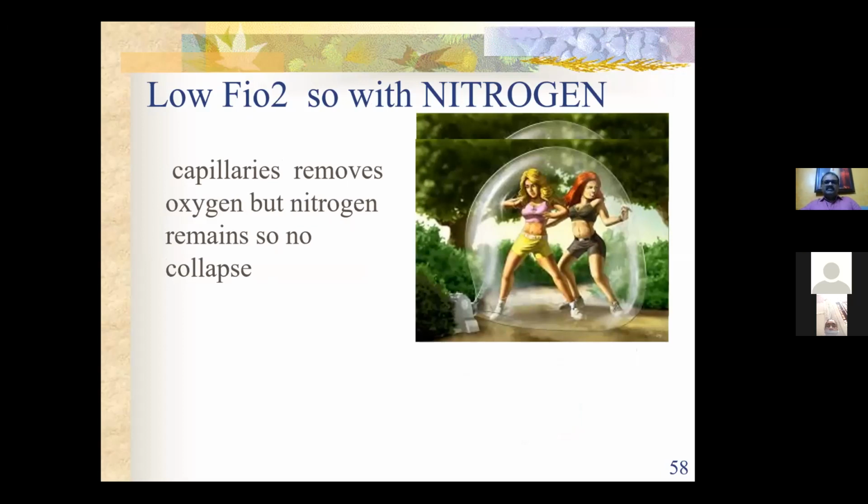In many cases, it might not be possible. In case of ARDS, if you are not able to bring down to 60% within 6 hours, then you prone. That is another indication for proning. If you're giving 100% oxygen, there can be collapse of the alveoli. When you're giving 60% or so, air can also be mixed along with the oxygen.